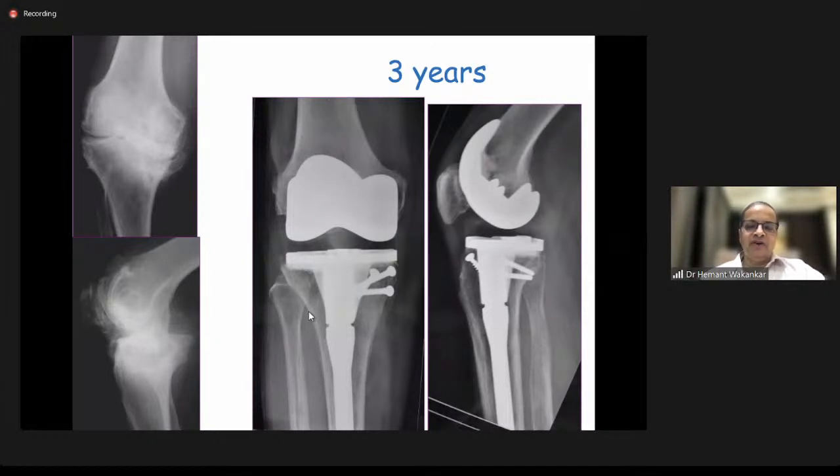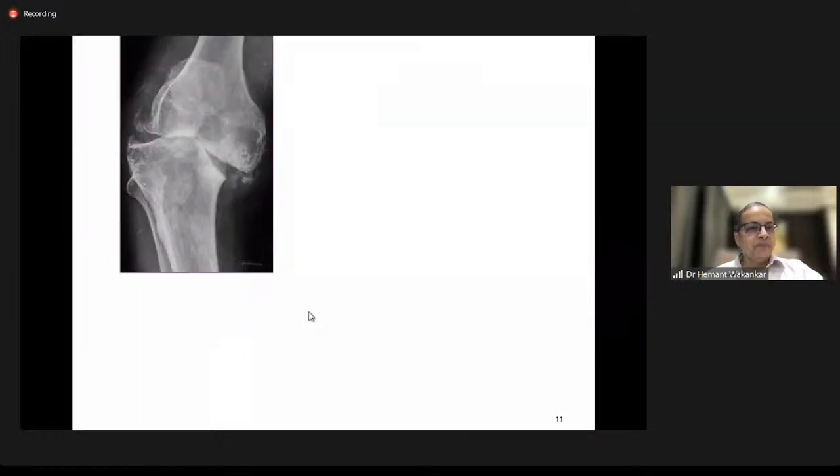If I have a defect that is involving more than 1/3 of that tibial plateau, either medial or lateral, then I would use a stem added onto the tibial base plate. Now, how does one assess whether one needs to add a stem? If it's a smaller defect, a simple trick is to take the leg through the range of motion using a trial component, a trial prosthesis. During this, you can observe what is happening to the tibial base plate. If it's tipping into the defect, then you need to add a tibial stem. It's a simple rule of thumb.